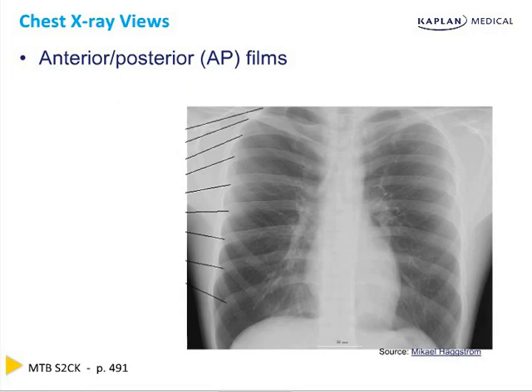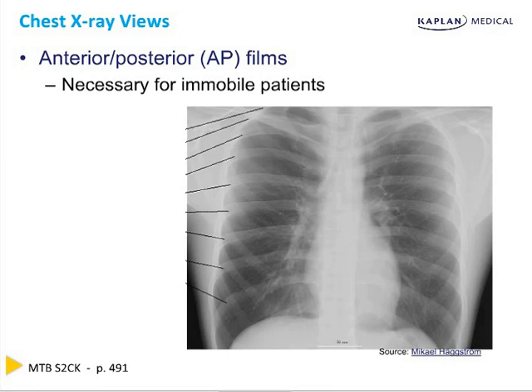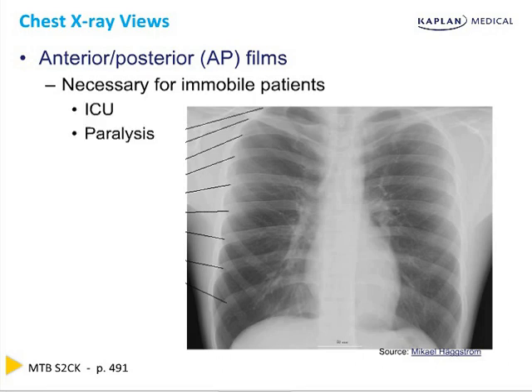Seen here is an anterior to posterior chest X-ray. While PA films are preferred for several reasons, AP films are often more convenient to obtain, because in a bedridden patient the cassette can just be slid underneath the patient and the X-ray source placed above the bed. Thus, AP films are often utilized in an ICU setting, as well as in paralyzed patients. Unfortunately, these images are often of inferior quality because they are taken by portable X-ray machines.